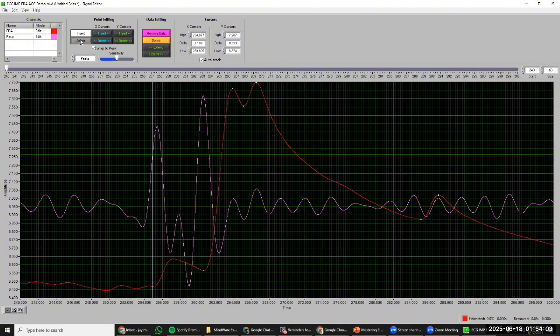And then we would want to continue to do the same thing for this other, even larger respiration that occurred here. So I'm going to again focus on this point of the respiration and then the trough location here. And we can see that unfortunately this one is also in that window. So we can go ahead and remove both the trough and peak of that SCR.